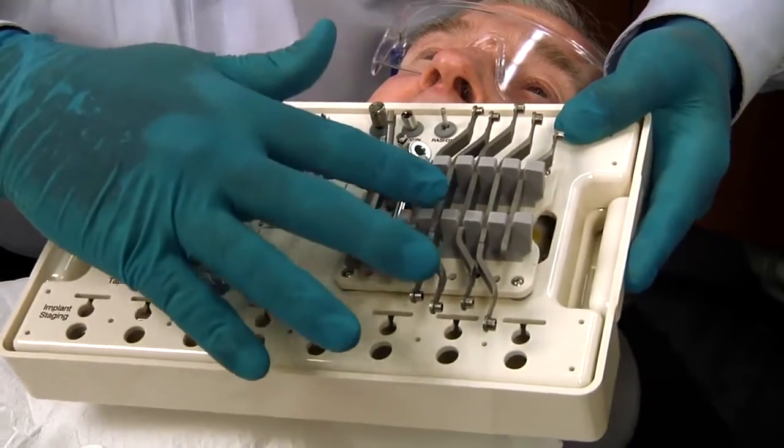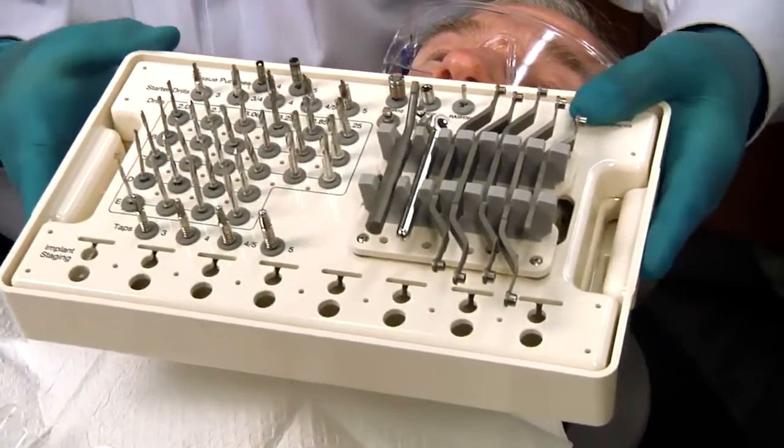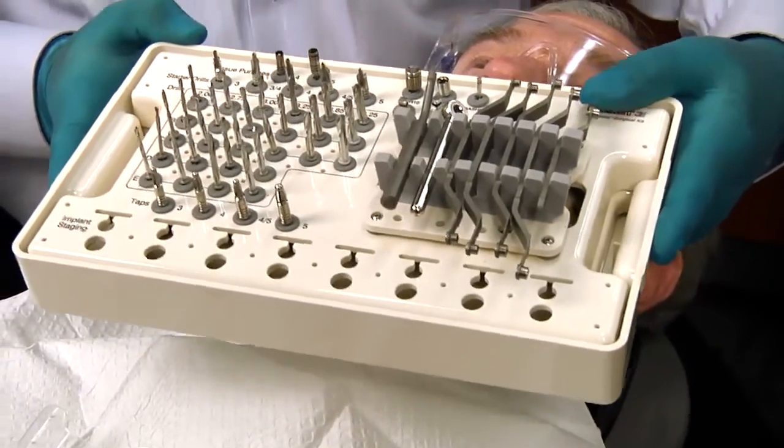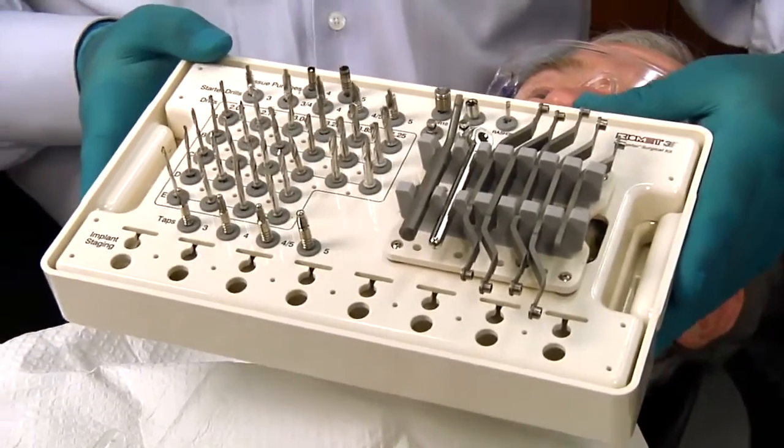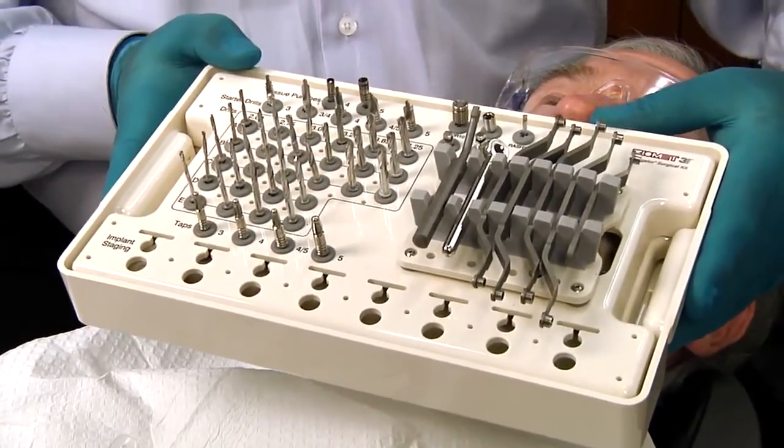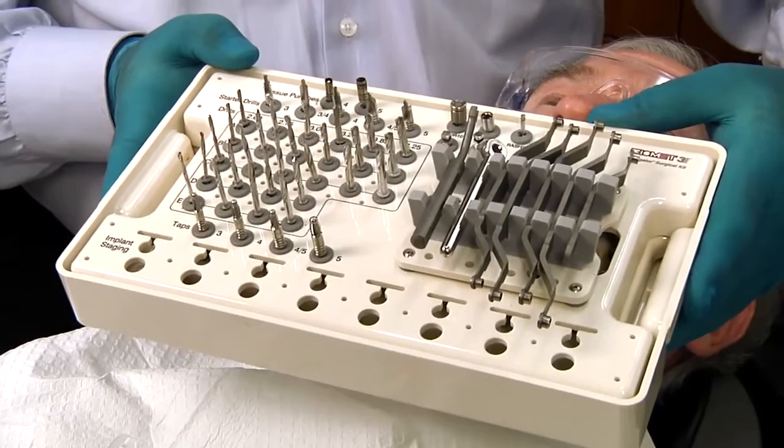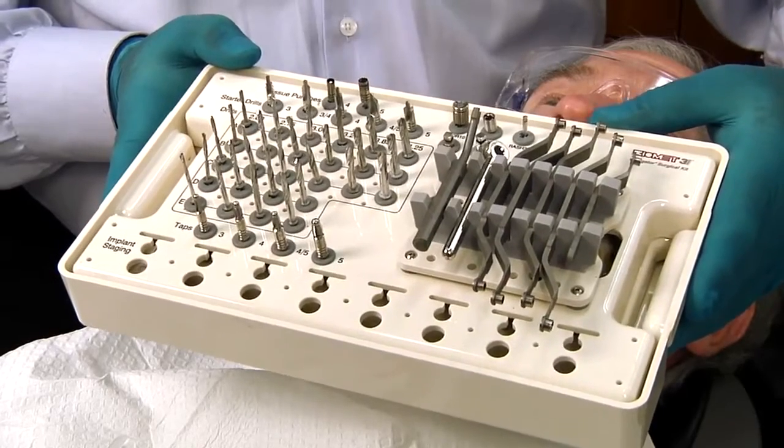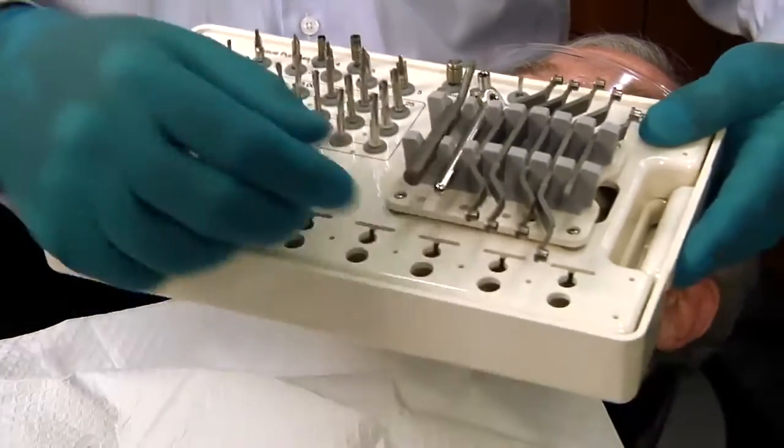The sleeves are what you put into the master cylinder. So if you noticed in my pictures, the master cylinders were, for example, say five millimeters in diameter and we're going to use a two millimeter starter drill. Well, the two millimeter starter drill will go anywhere in that five millimeter diameter master cylinder.